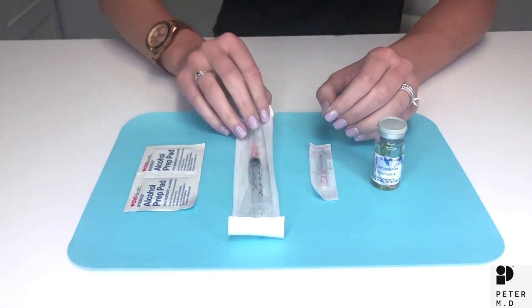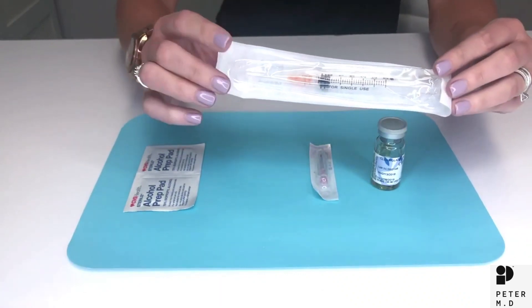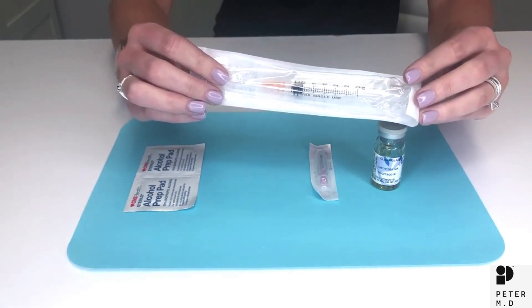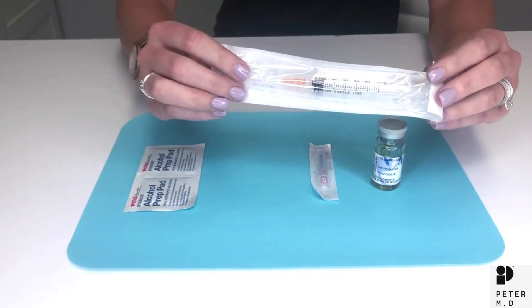There are two parts to an injecting device: the syringe and the needle. When we talk about the size of the needle we are referring to the gauge. The bigger the number the smaller the needle. You will also see a length denoted on the needle — half inch, five-eighth inch, one inch, etc.